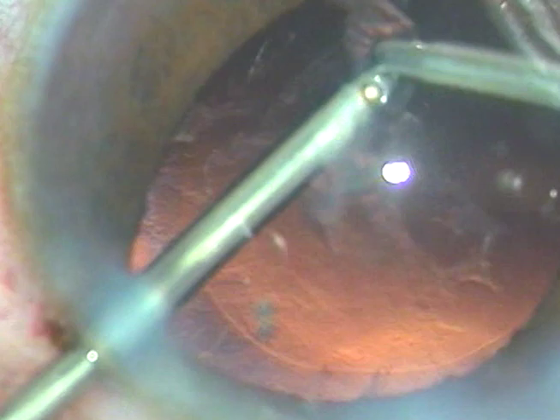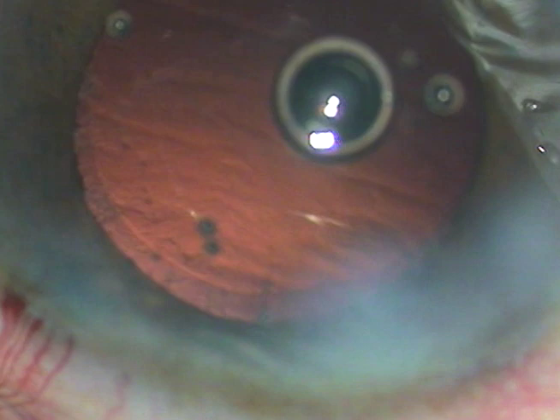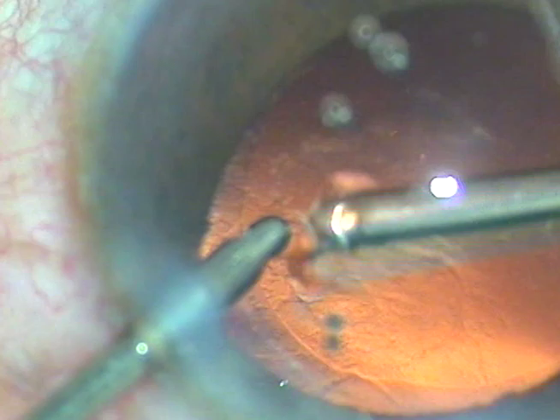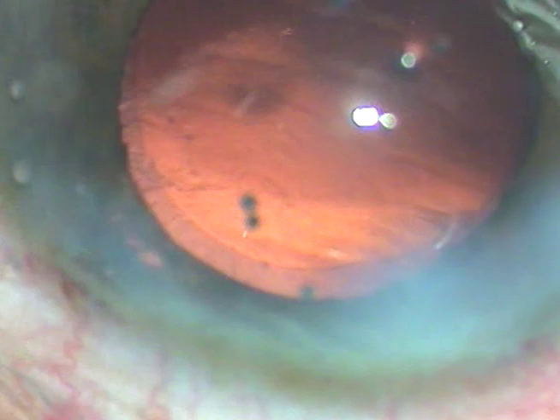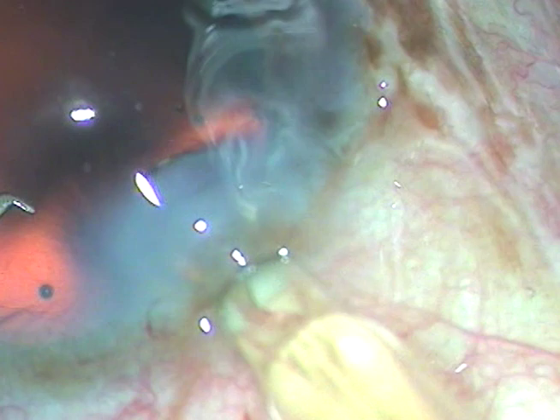I am cleaning whatever little cortical matter remains with the help of bimanual IA in IA2 mode with very little vacuum and flow rate — this is actually capsular polish mode, but I am able to remove the lens fibers. The posterior capsule has some fibrous tissue at the center which we cannot polish out; if necessary we have to do an Nd:YAG capsulotomy later on. After injecting viscoelastic substance, a hydrophobic acrylic intraocular lens is being implanted in the capsular bag.